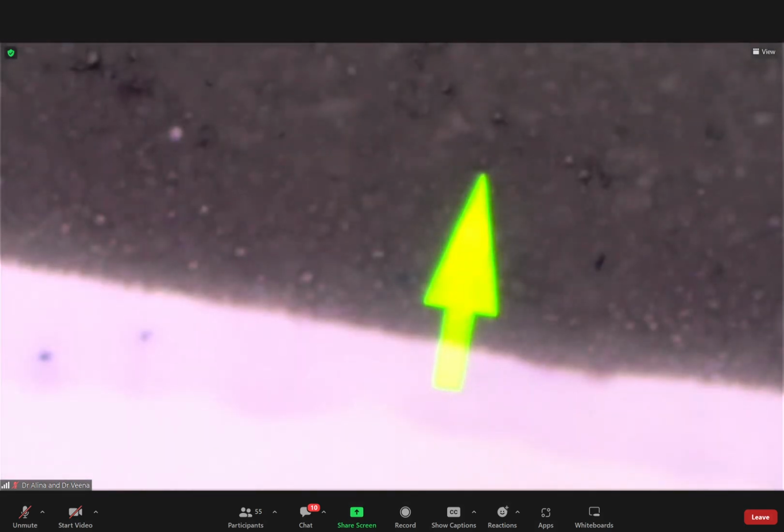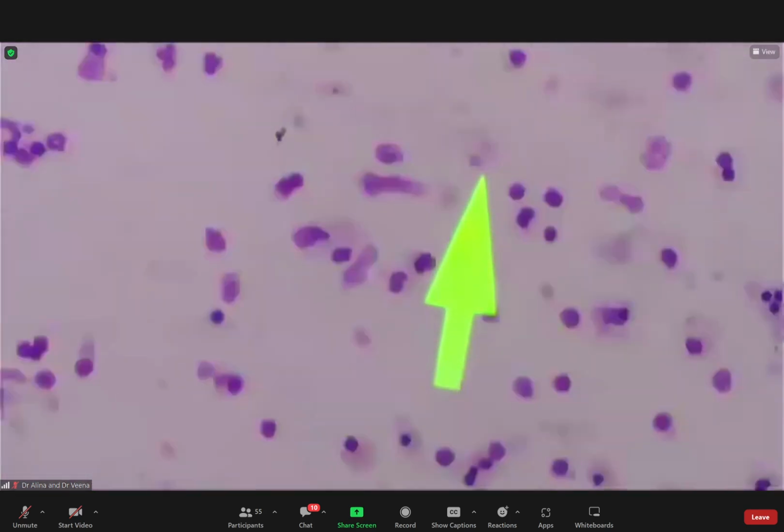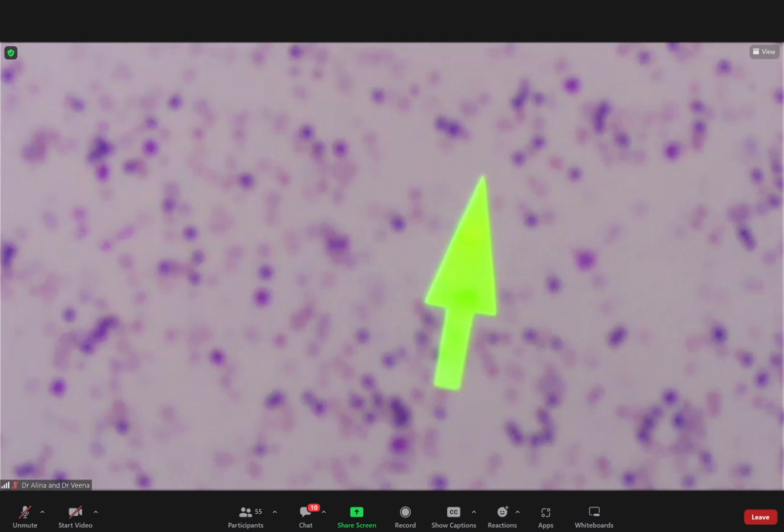So sorry, just back to the MAHA patient. So basically that is MAHA. The other differential diagnosis is also DIC. So that's also something that you might need to consider by doing a coagulation screen if it is a more long-standing case. But of course, the giveaway here is the hypersegmented neutrophils. That is too many hypersegmented neutrophils.